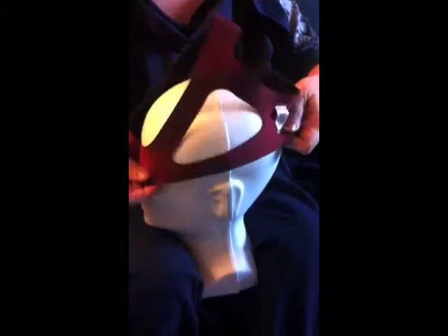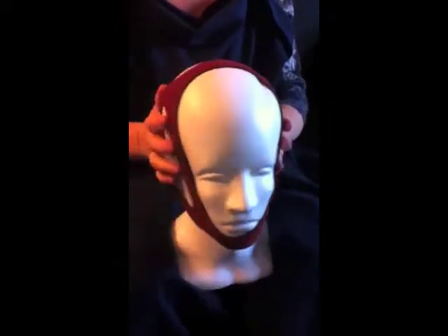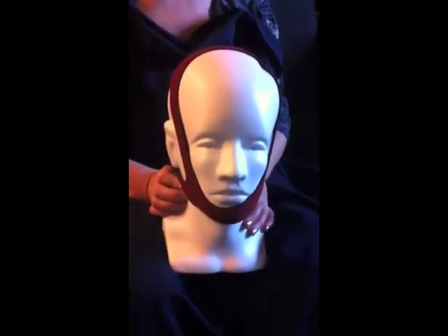Opening up the chin strap with the curve being in this hand and the label being in the back. I would take it and pull it securely forward, up over the patient's chin, secure it underneath, making sure that the sides aren't touching the patient's ears and always that the label is in the back. So there you have the TMS-09 in small, medium, and large.